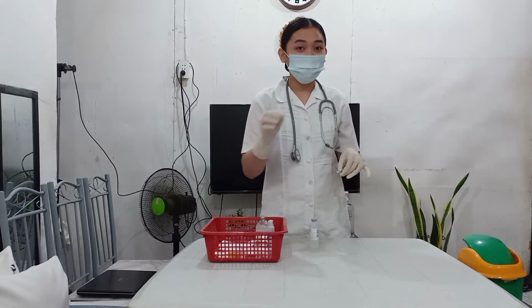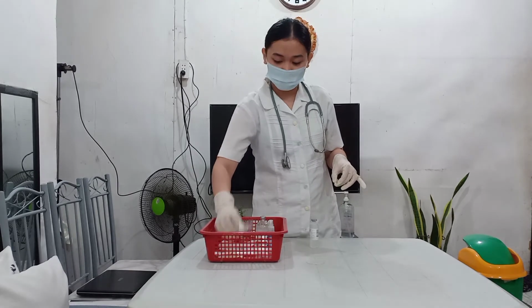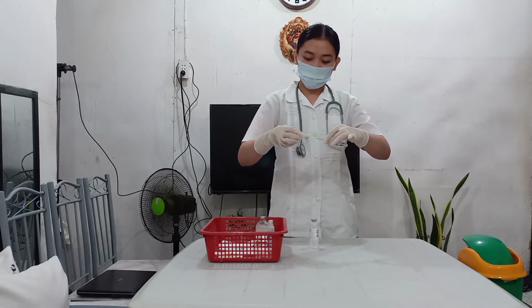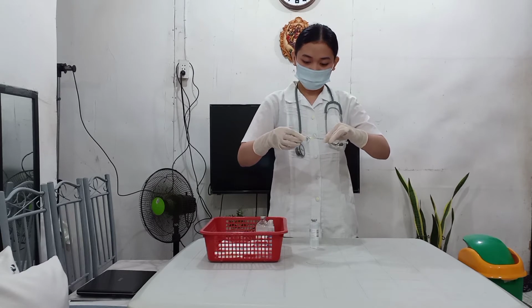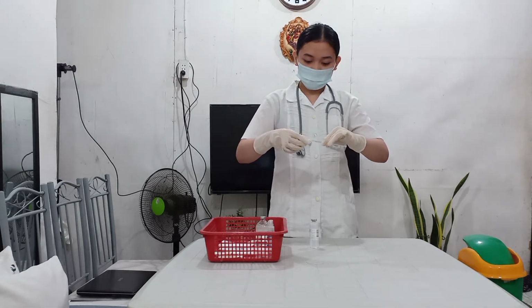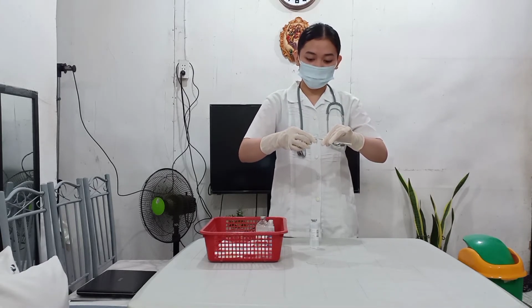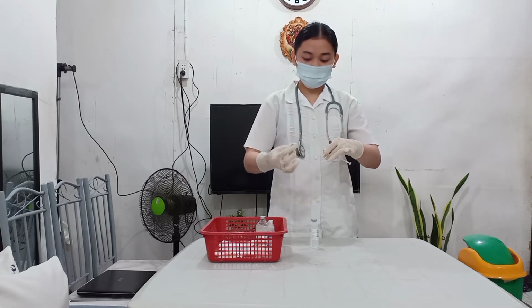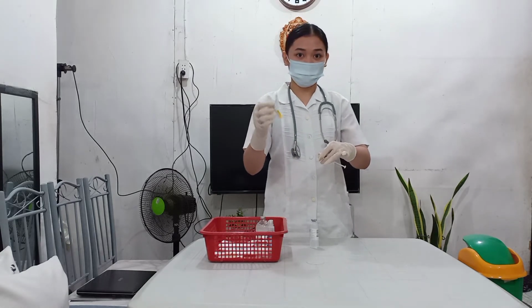So, I am going to get the cap again of the filter needle. I'm going to place it here. Then I am going to remove the filter needle. Now I will dispose of it in a sharps bin.